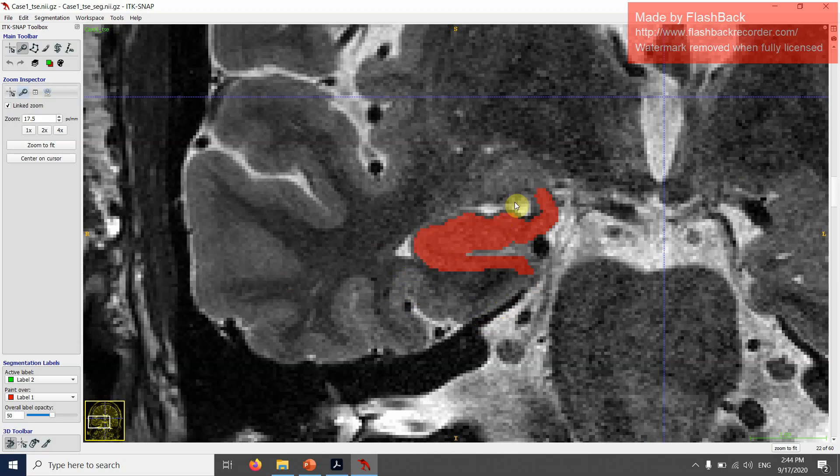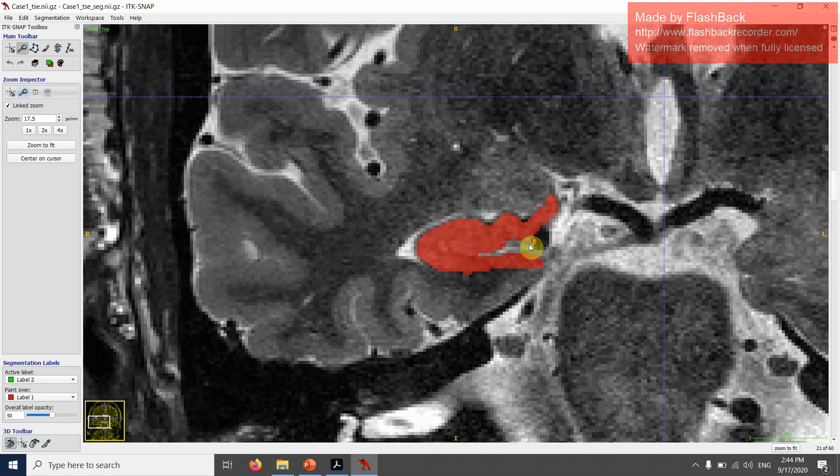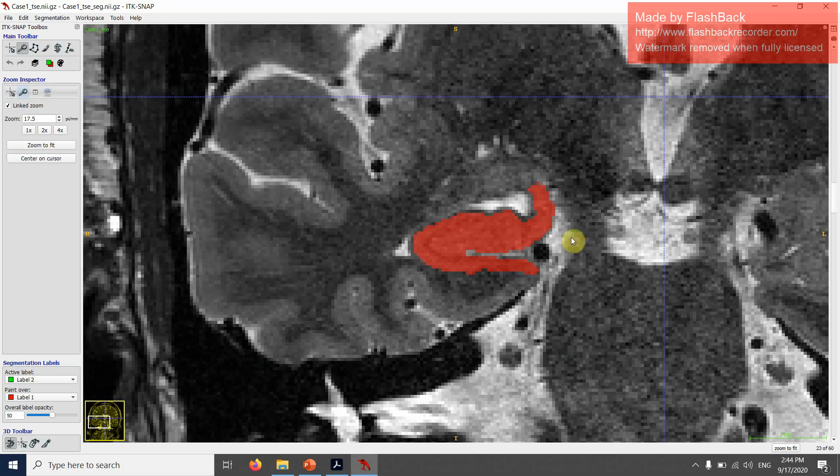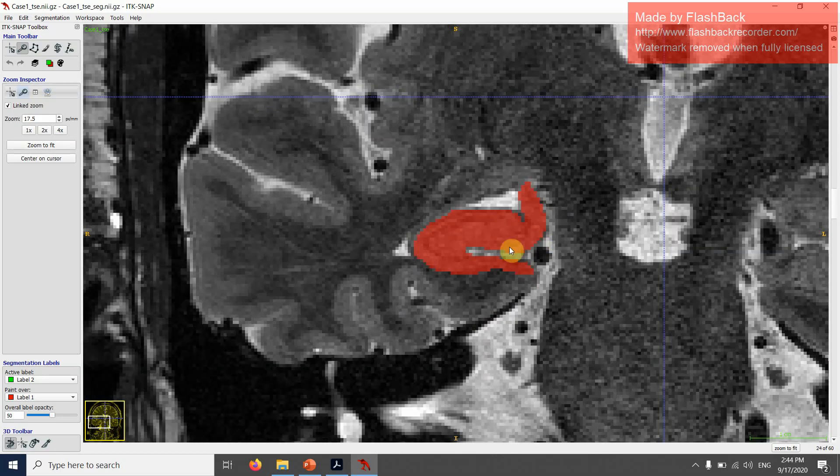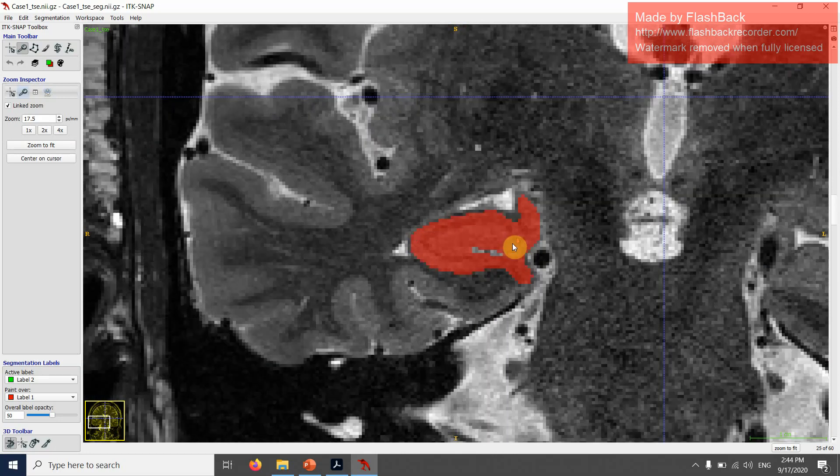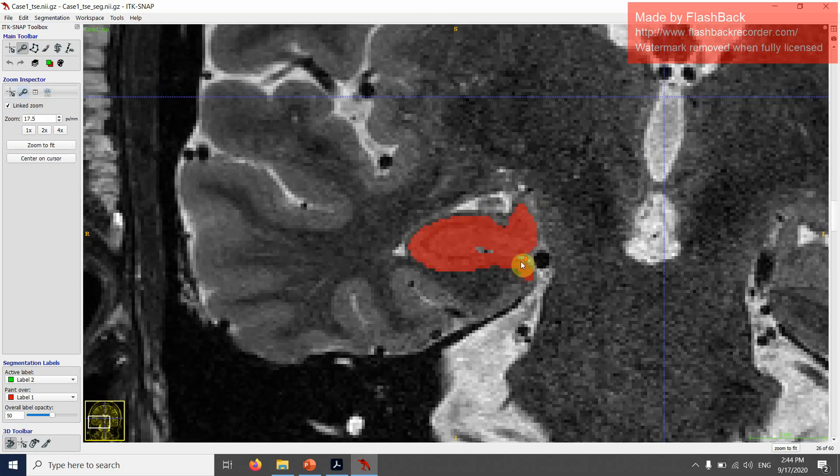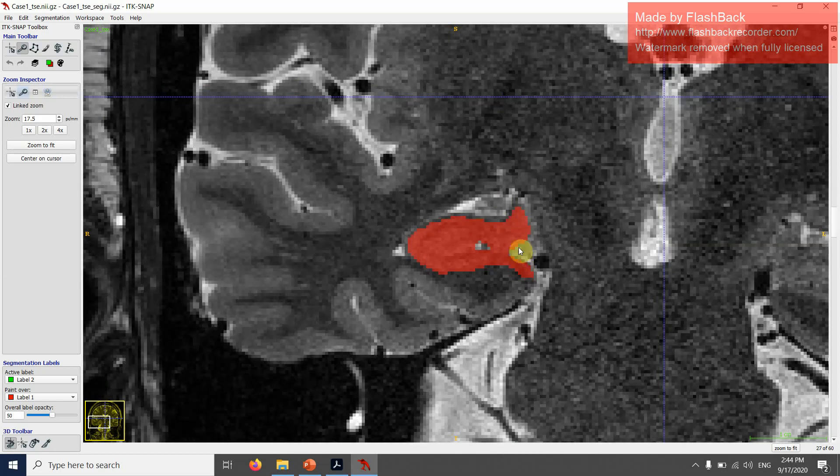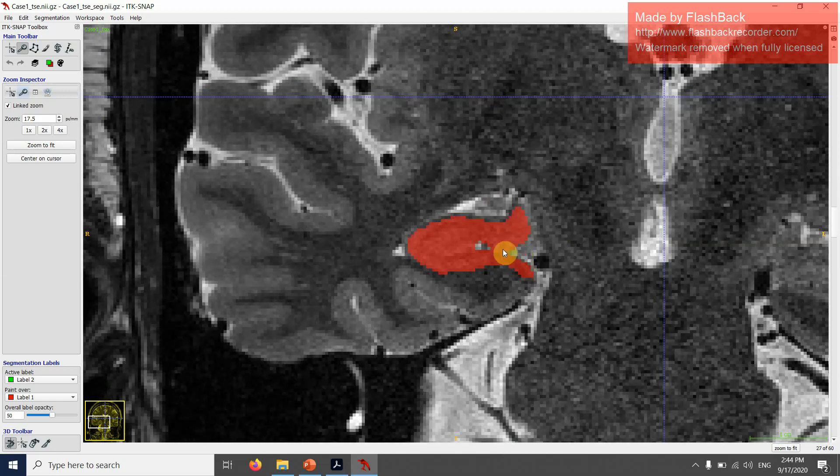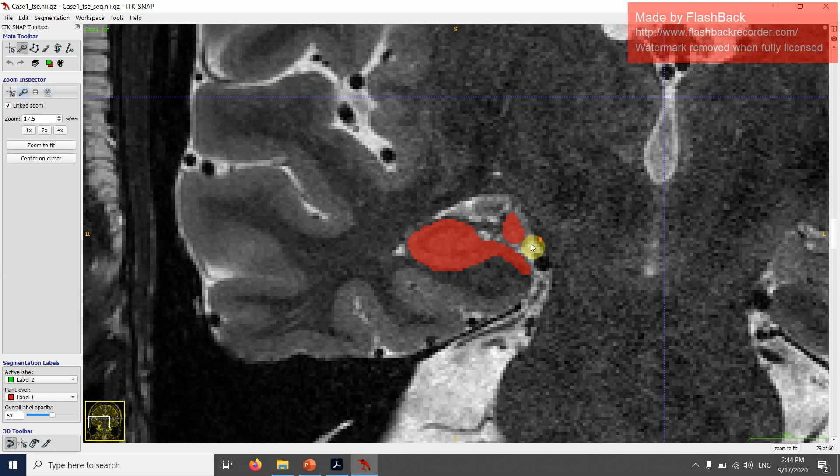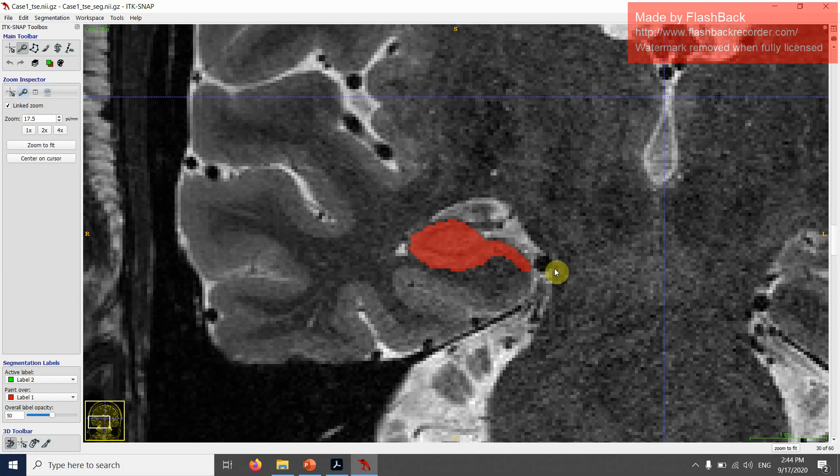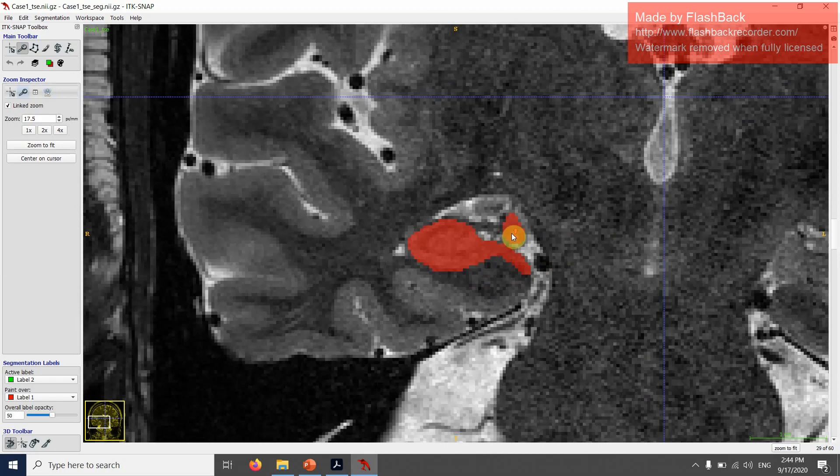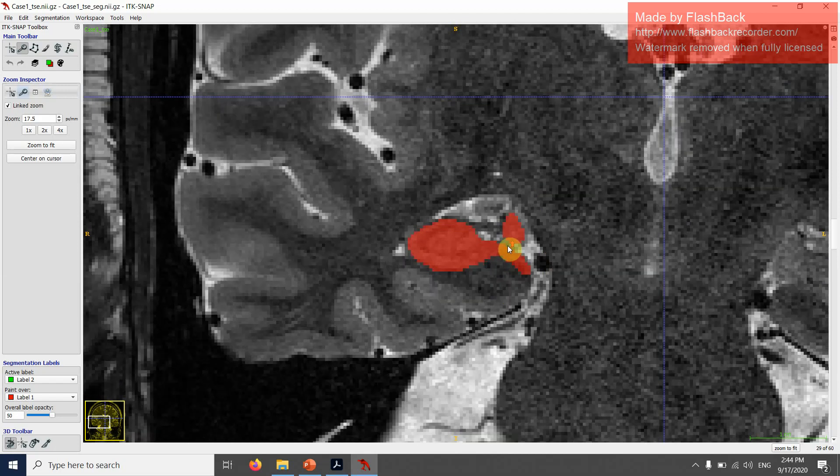The uncus is the medial portion in the anterior part of the hippocampus. This is lateral, this is medial, so this is the uncus. Now I'm just going to follow it in a posterior direction and I'm going to see if it's still there. Here you can see it actually separate from the rest from the hippocampus and that's actually pretty common. Then in the next slide you can see that it disappears.